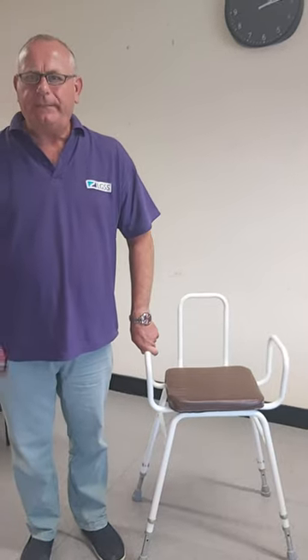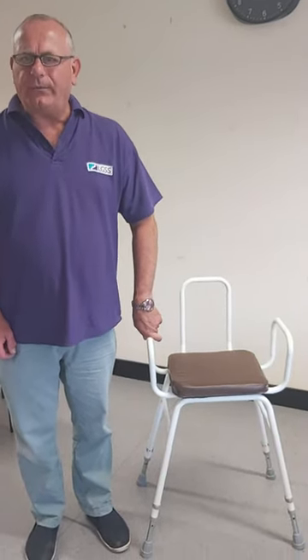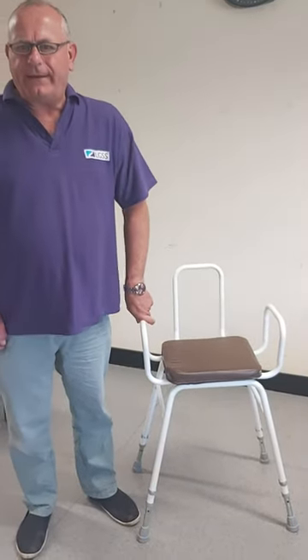So here we have the perch installed. The weight limit on this piece of equipment is 20 stone. It's height adjustable with a padded angled seat which is lower at the front and wider spaced for extra stability at the back.